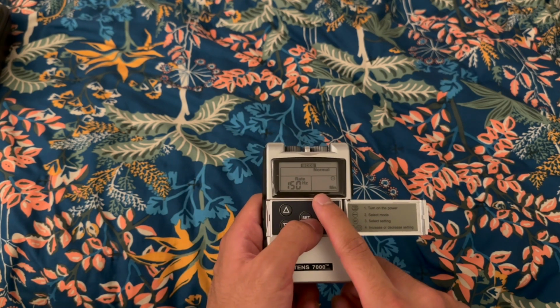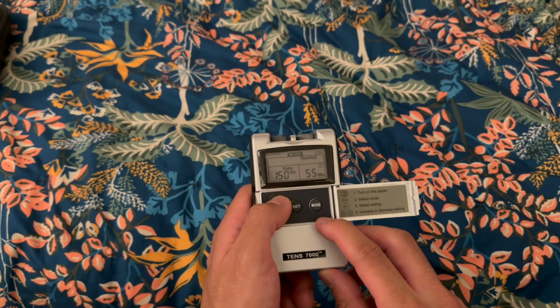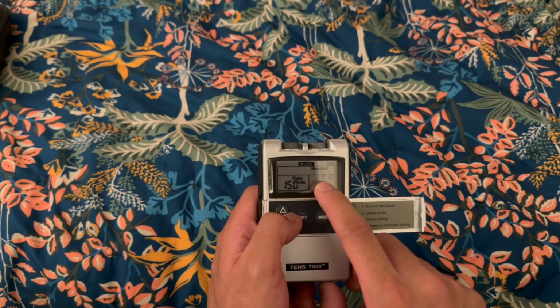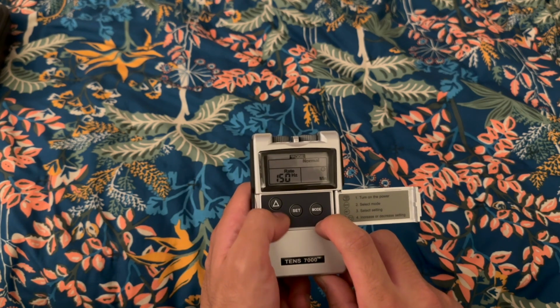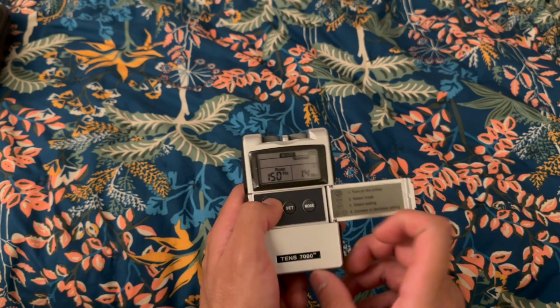With time, this can be adjusted to however many minutes or hours one might like. This goes all the way up to where it can just have no time limit at all. It could be continuous, or it can just be as short as 1 minute. For clinical sakes, we'd typically be around 10 to 20 minutes just for time purposes.